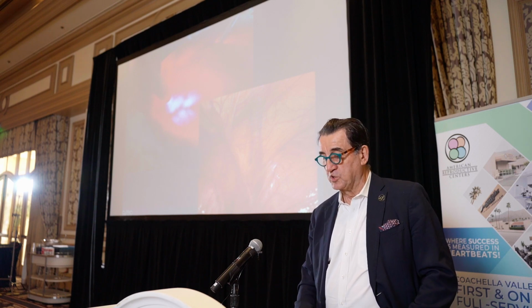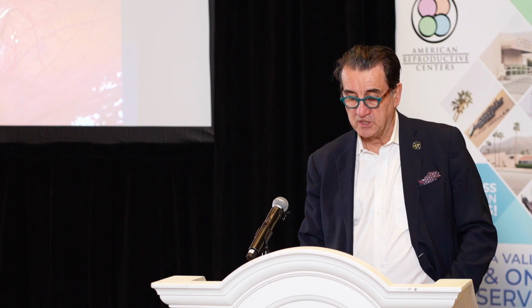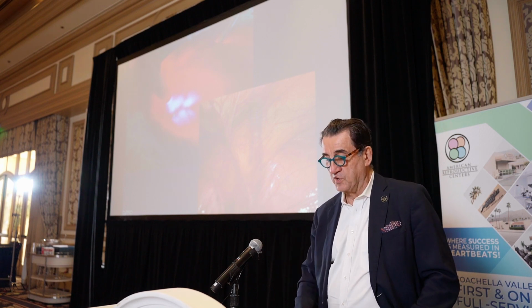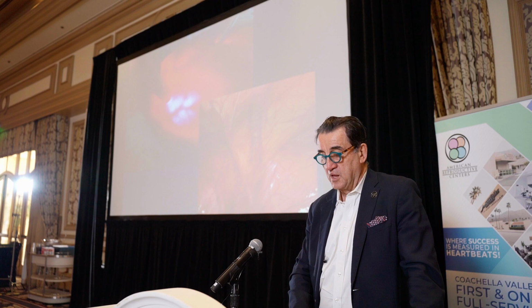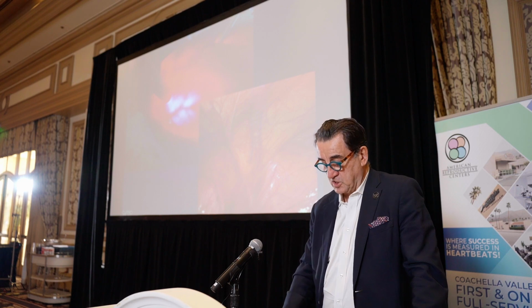The inferior one you can only see through the laparoscope, and you will see one artery followed by two veins, and the superficial one you can trans-illuminate. The inferior one you cannot trans-illuminate because it's at the lower part of the abdomen, I mean the inner part of the abdomen. I'm holding my finger here on the inferior epigastric, and this is the superficial.